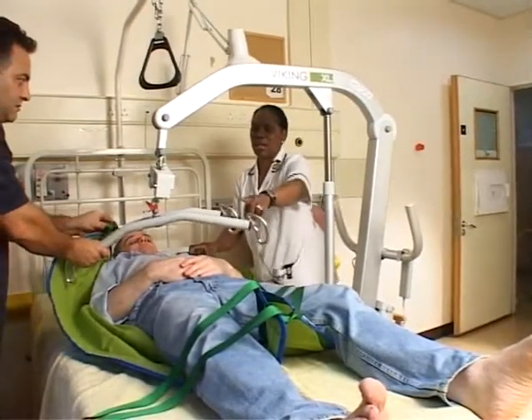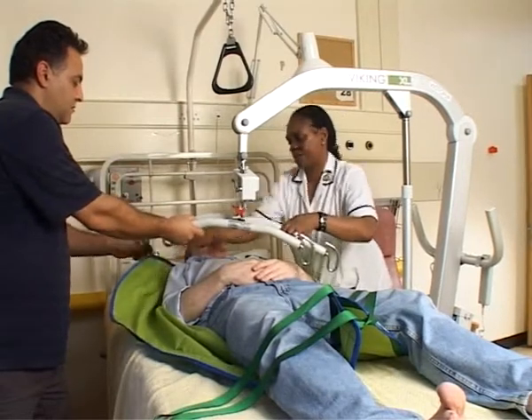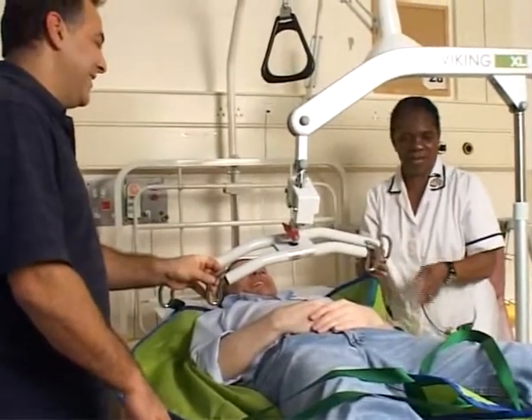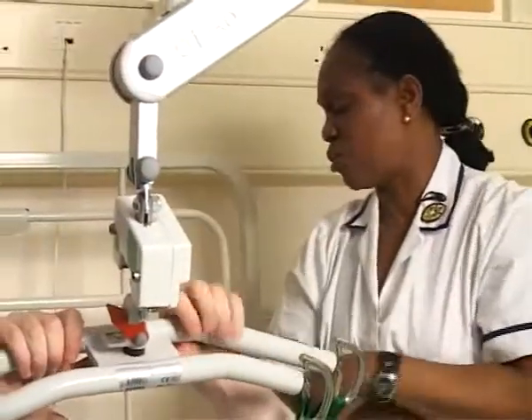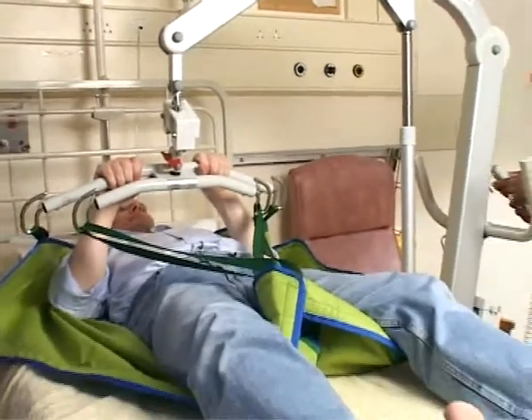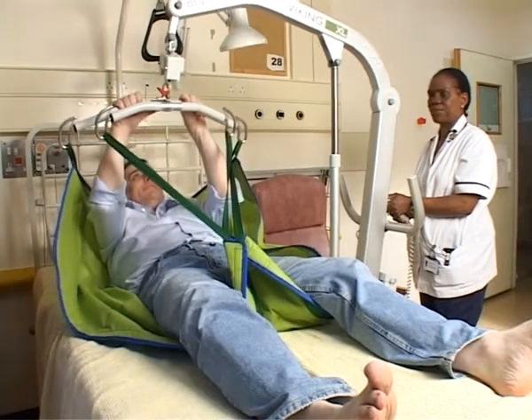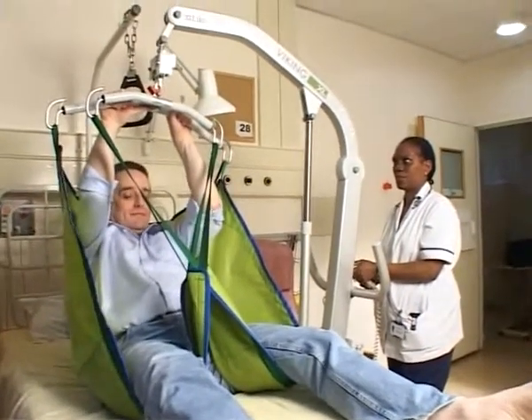Attach the sling to the hoist. Now the head bit goes round, so we need to turn — that's the head — so that bit goes there, in and under. The patient has very good head control, lifting his head. The reason why we have a lot of patient lifting equipment is it's not only beneficial towards the patient, but it's beneficial towards the staff, because it saves them from doing manual lifting, which is a major cause of back problems. So the lifting equipment enables the staff to use an aid to lift the patients and transfer them without hurting themselves.